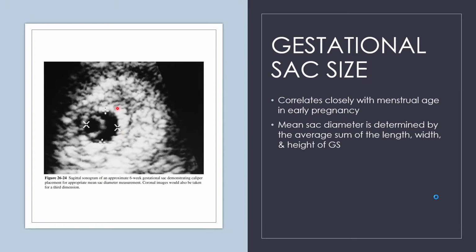Okay, this is the gestational sac right here. And we measure inner to inner, okay, when we're measuring the gestational sac. So this is the inside of the gestational sac. This here is the yolk sac, okay?